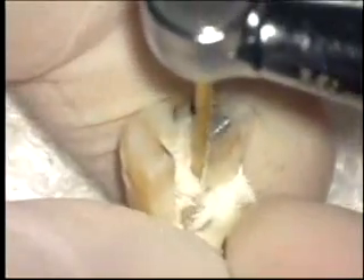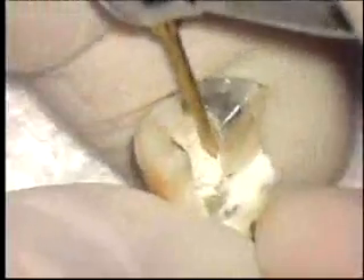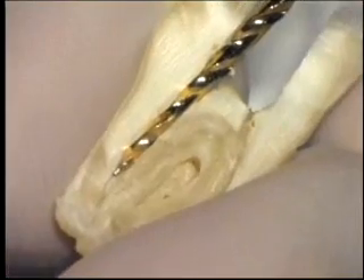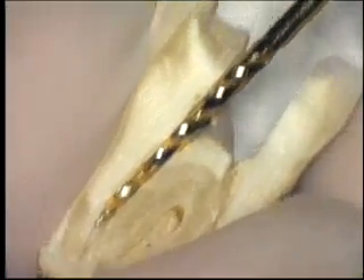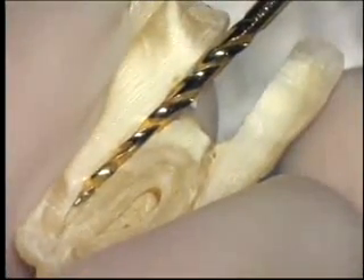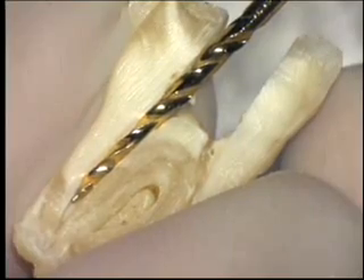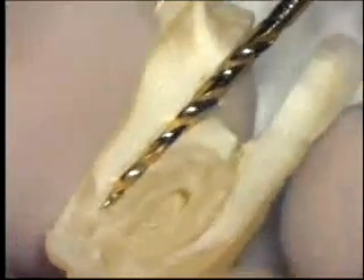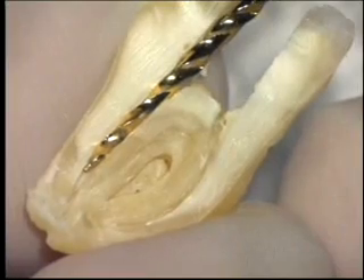A serendipitous finding in testing prototypes of the fluted LA access burrs was how rapidly they could open up canals with no cervical curvatures. At 5,000 to 20,000 RPM, these instruments can cut most of the shape needed in the coronal half of root canal preparation in less than five seconds, greatly reducing the fatigue on the nickel titanium shaping files to follow.